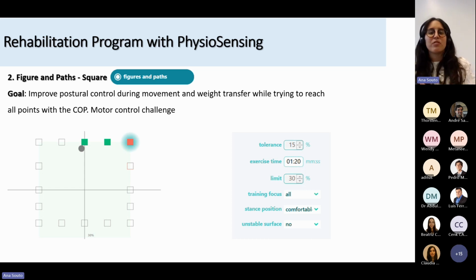And now the patient, for example, if I selected here the right side, only targets on the right quadrants will appear. I think for starters, and because he also has trouble moving on the left, as we saw, we can do a complete square. Because every time you do an exercise there's a report, we can compare the displacement on the right quadrants to the displacement on the left quadrants, and also continue the assessment while training, okay?